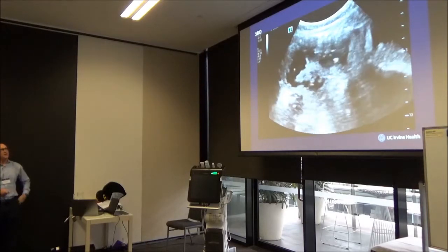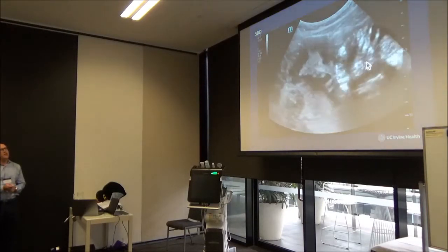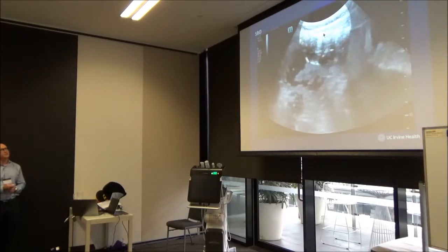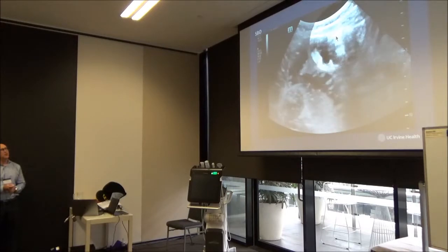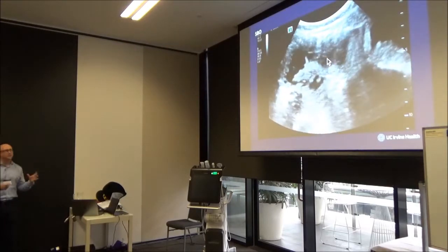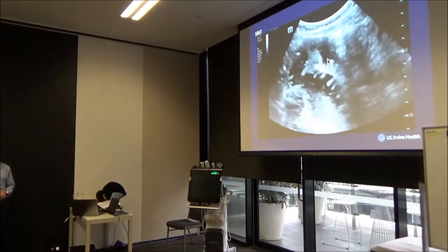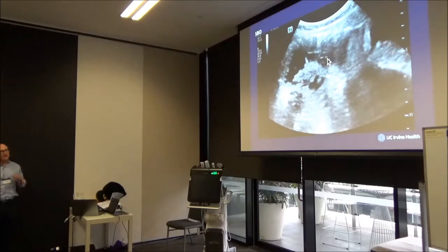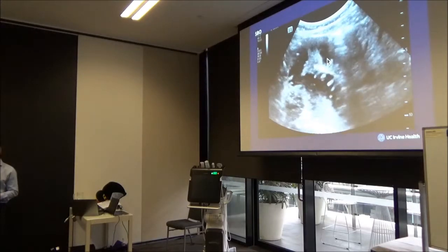Classic small bowel obstruction. If you look over here, you're at your centimeters. This is 2.5, 3 centimeters. Right when you get to about 3 centimeters, that's when you're seeing that back and forth there with the distended loop of bowel. When you're mid-position, you measure it. If it's 2.5, 3 centimeters, you're there for the diagnosis.